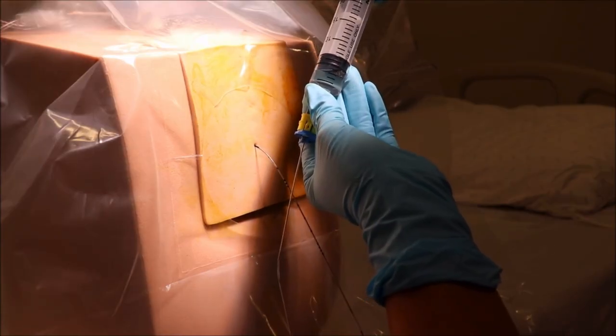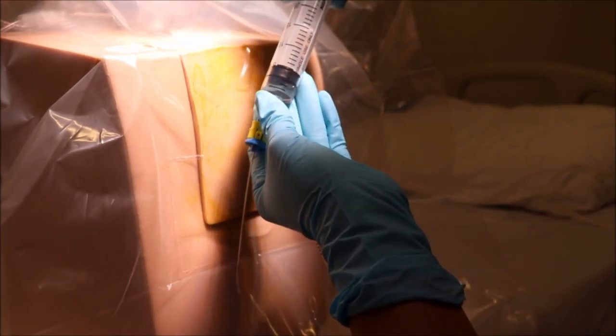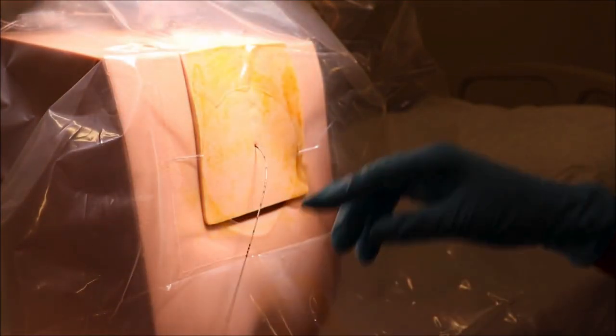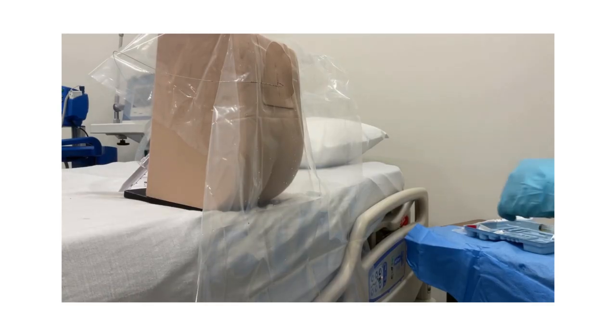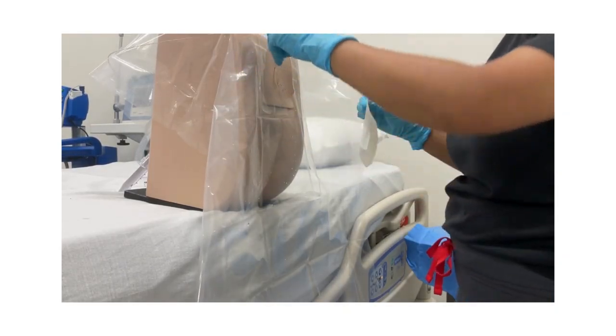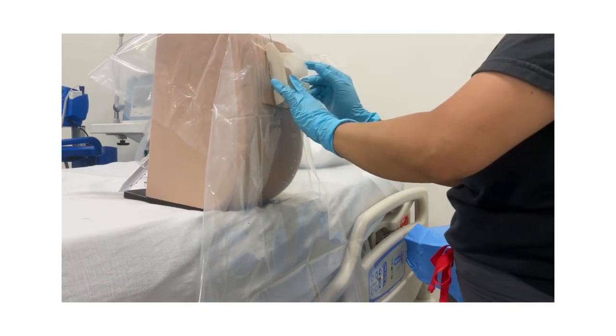If the patient's legs feel warm or heavy, the catheter is in the intrathecal space. If the heart rate increases by more than 20 beats per minute within 30 to 60 seconds due to epinephrine, the catheter is in the blood vessel. If the patient's vital signs remain unchanged, I'll go ahead and secure the epidural catheter with a transparent dressing so you can see the insertion site for future assessment.